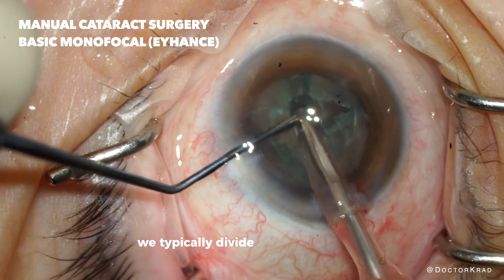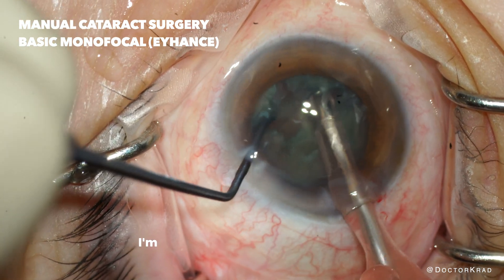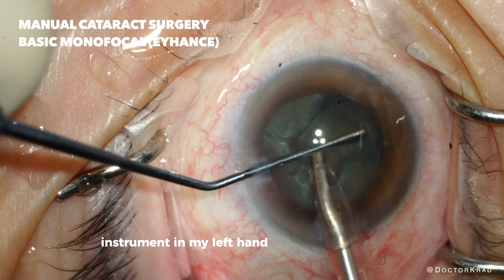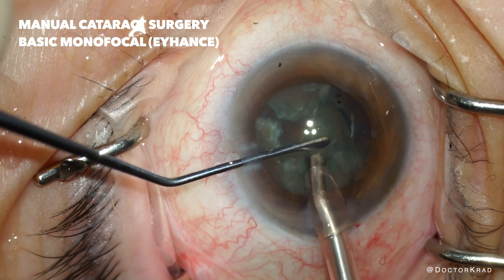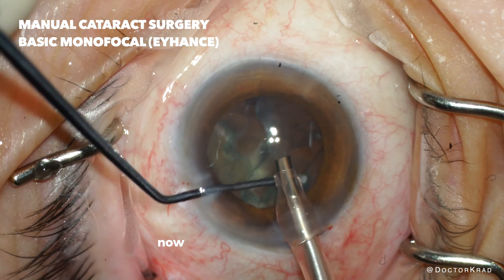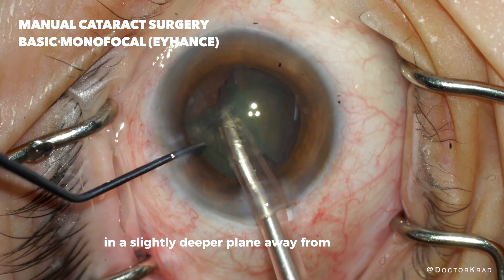We typically divide it into four pieces. After I have the lens in four pieces I'm going to vacuum up each quadrant, using the metal instrument in my left hand to protect the cornea. Notice how I have the left hand instrument in front of the cataract so it doesn't bump into the cornea and cause damage. Now that I've created more space I can emulsify the last two pieces in a slightly deeper plane away from the cornea.